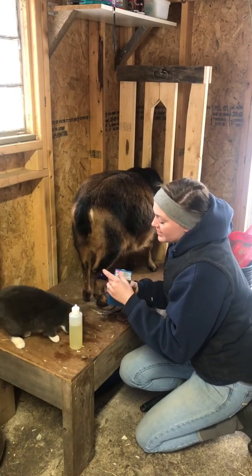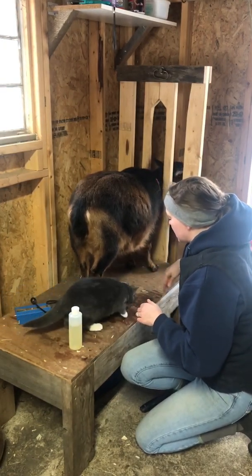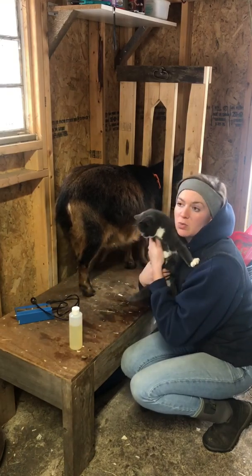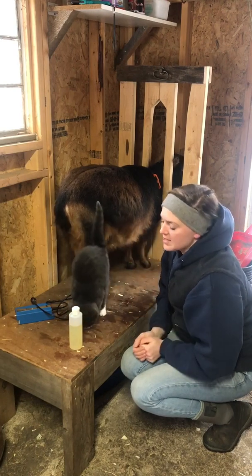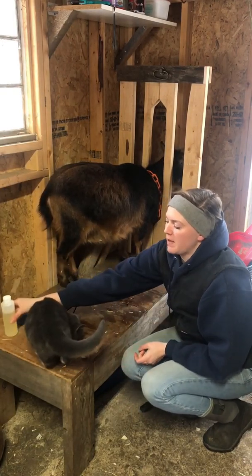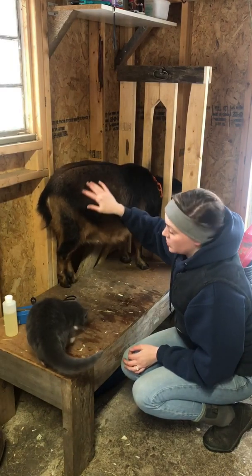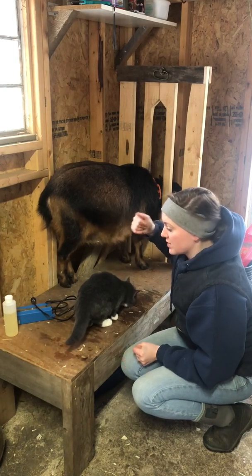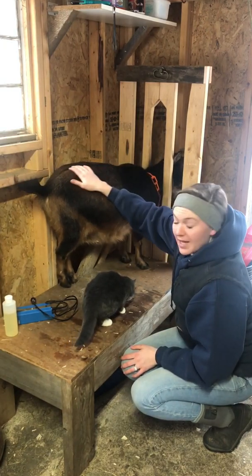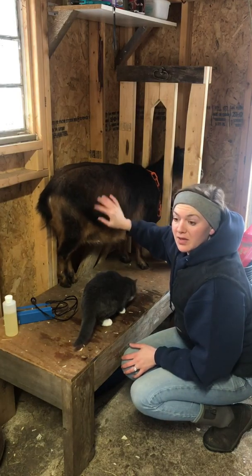Very good news — we're very excited. Audrey is the first to kid. She technically has two due dates because she was bred twice the same week. March 30th is her first due date, which would be 145 days from the first bred date. She could go before or after that, but March 30th is when I'm first expecting. After her, Ruby — I can do an ultrasound in a week and a half to test if she is pregnant, and she hasn't gone into heat yet, which is a good sign. Then Allison, I still have several weeks before I can test her because she was only bred about a week and a half ago. Stay tuned — sure to have lots of babies on the way, starting with Big Marie in February and then followed by Audrey.